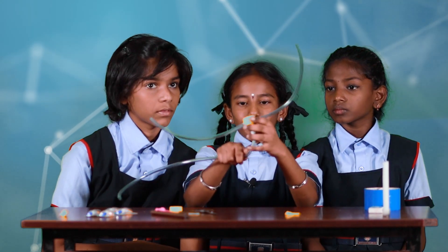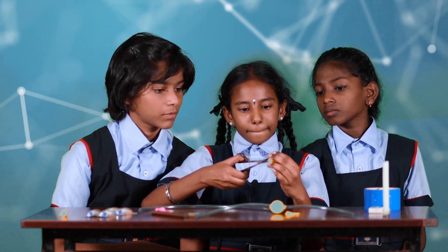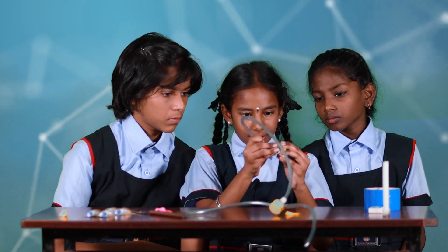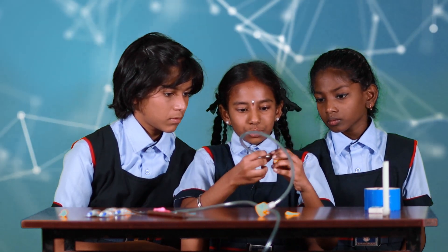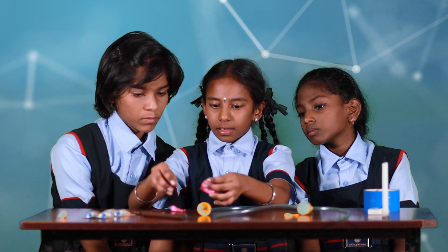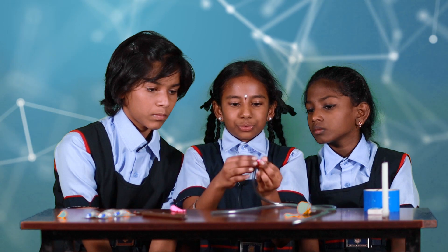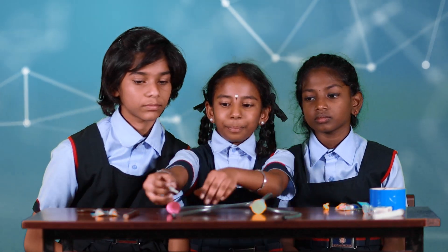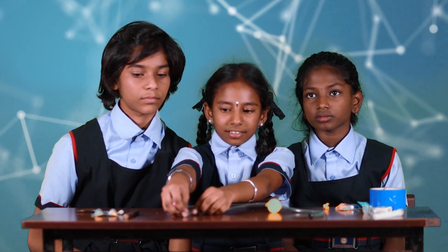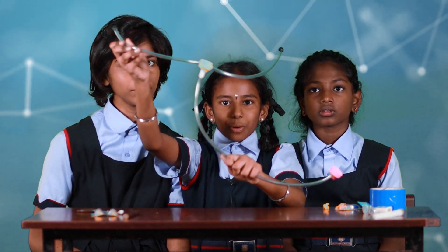Now put the rubber band to secure it. Take another tube and put the rubber band. Cut the tip of the balloon, cover it, and add another one more time. Now with the help of the glue, paste the ear pads. Now we have made it — the stethoscope is ready!